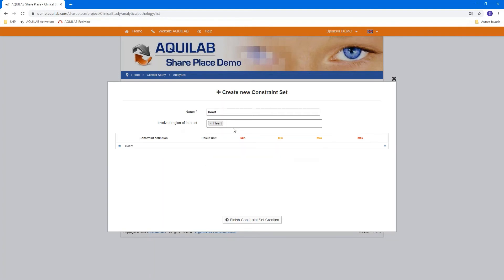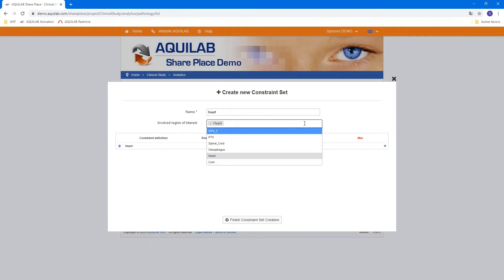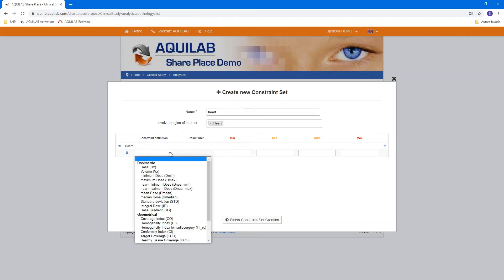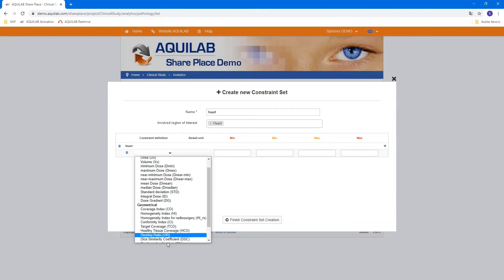You can select the region of interest. Here is the heart. You can select GTV, PTV, all the renamed structures present in the harmonized structure. The heart is here. And you can now add a definition for your constraint.